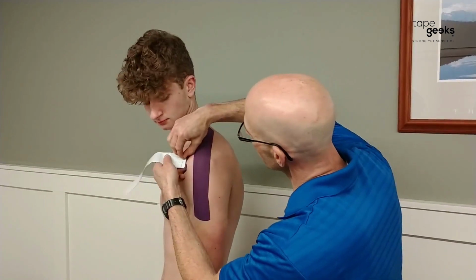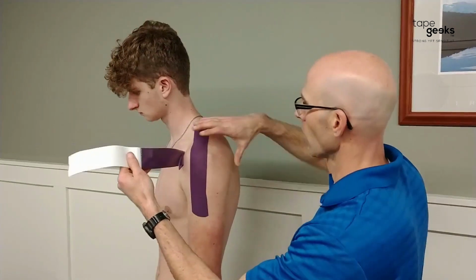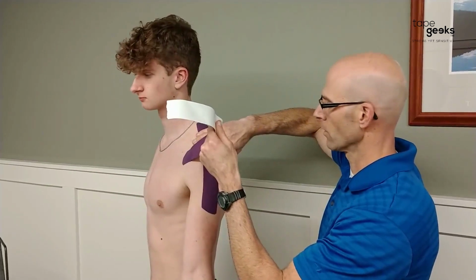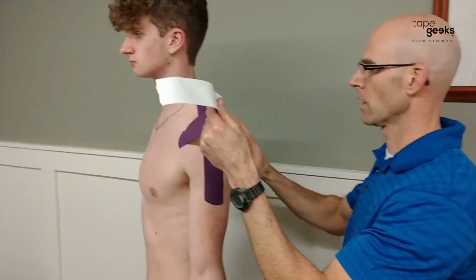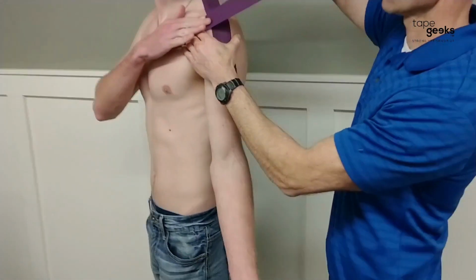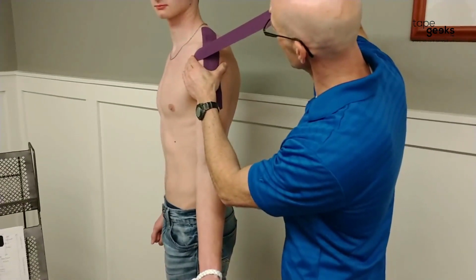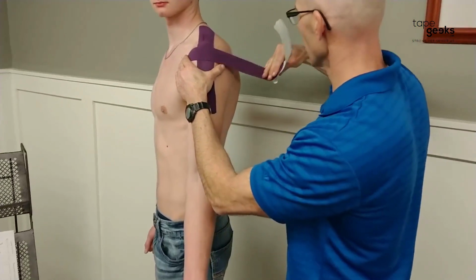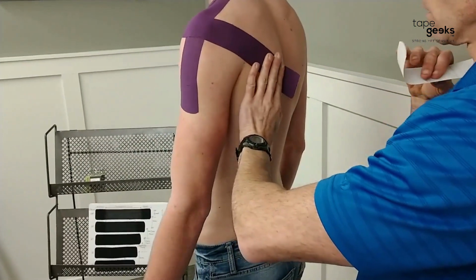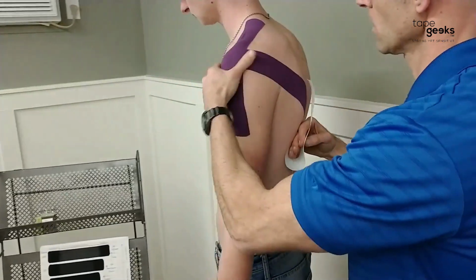So I want to bring this tape. Now I want the individual to go into position, so we'll go ahead and, yep, there you go. Retract your shoulder blade back, actually rotate your arm, perfect, just like that. And I'm going to hold this there so I don't get any tension on that. I'm going to give him about 50%. So I come out to 100 and then go back half. Lay that down at an angle. And then again, no tension at the end. Rub it to activate the adhesive.